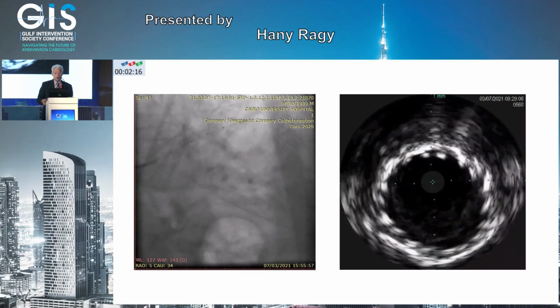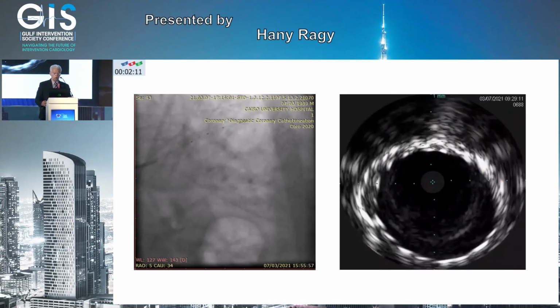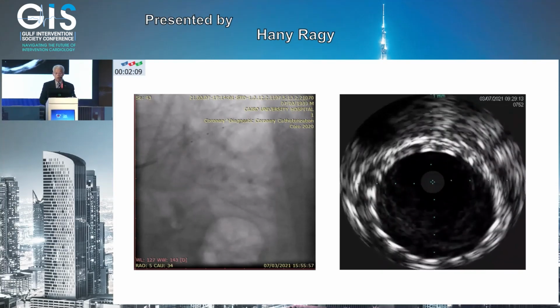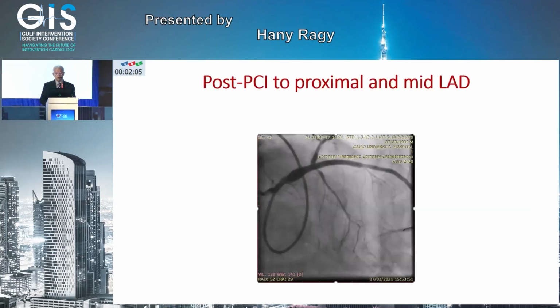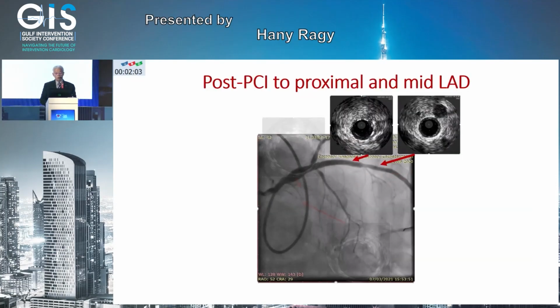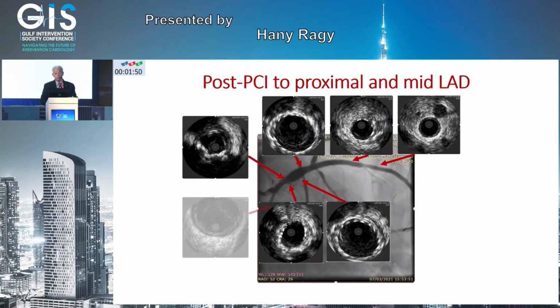You look at the stent here. You see here, the same stent, because of this type of self-expanding stent. So again, sometimes you need to use different tools like a self-expanding stent. This was the end result of this patient. And you can see the stent in the two lower frames, in different parts of the artery, the stent grows to go up to the wall.